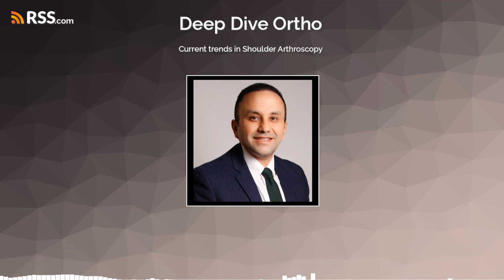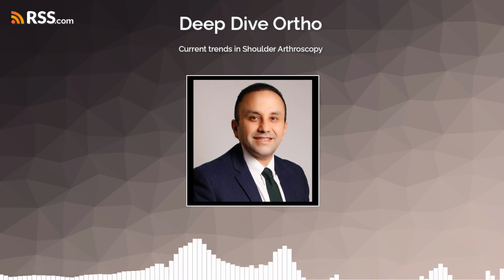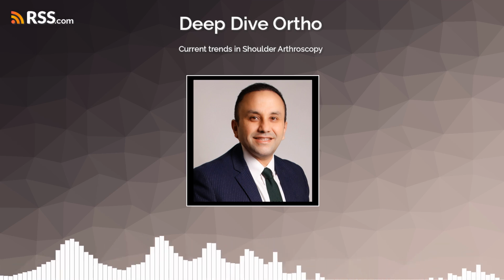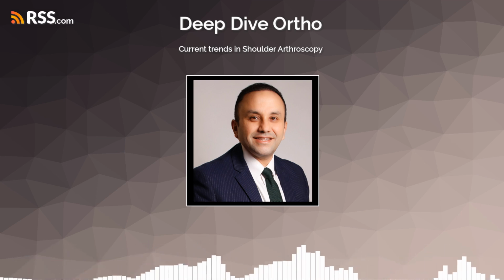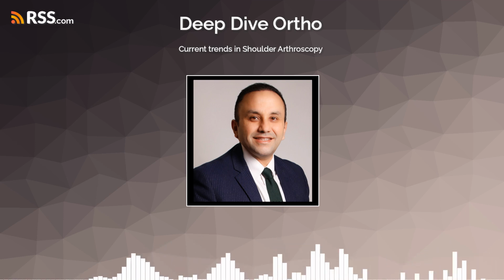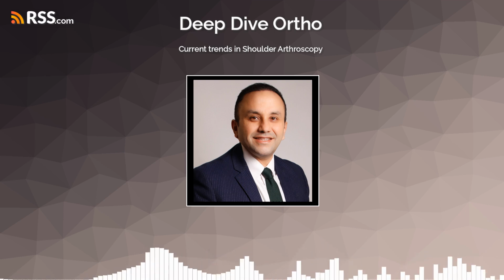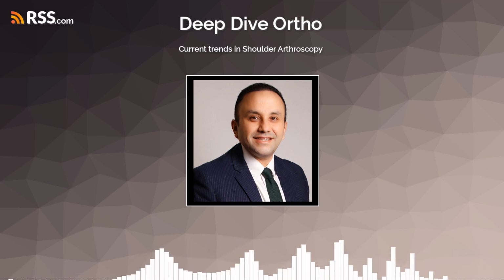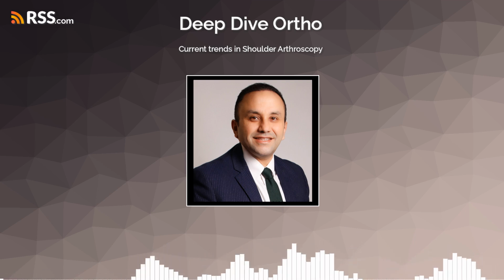And there's also the acromial index, a measurement we can take on X-rays. What does that tell us? The acromial index, or AI, is a ratio. It compares 2 distances measured on a frontal X-ray of the shoulder. Okay. It's the distance from the edge of the glenoid socket to the outer edge of the acromion, divided by the distance from the glenoid to the outer edge of the greater tuberosity. So a bigger number means the acromion sticks out more. Exactly. A higher AI value means the acromion extends further laterally, or sideways. Studies have shown that people with a higher acromial index are more likely to experience subacromial impingement and have rotator cuff problems. Interesting correlation. Yeah, for example, people who don't have any shoulder issues tend to have a lower AI, while those with significant rotator cuff tears often have a higher AI. It just gives us another piece of the puzzle when evaluating shoulder pain.